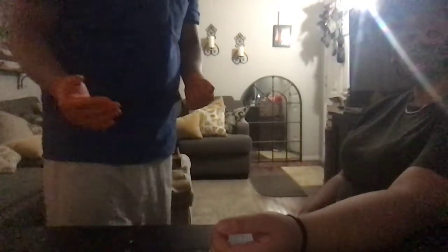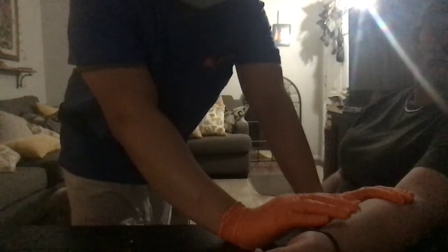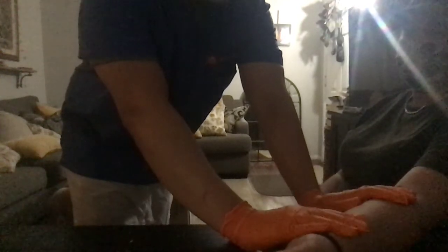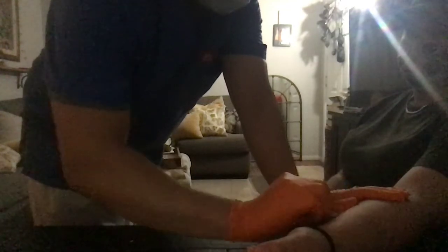Now I'm going to place four fingers away from the elbow, away from the wrist, and away from the hairline, making sure that once I pick my site, it's not on a vein or near a vein. Now that I have my site picked, I'm going to get my alcohol wipe and wipe the area, getting rid of any bacteria that's on the skin.